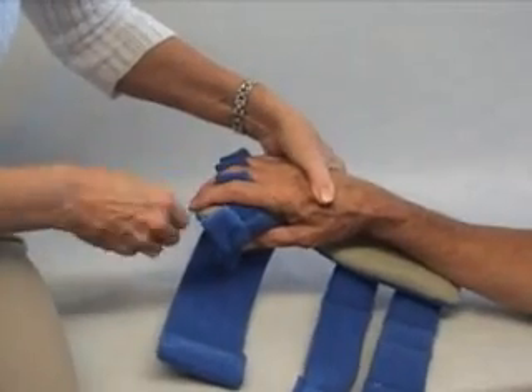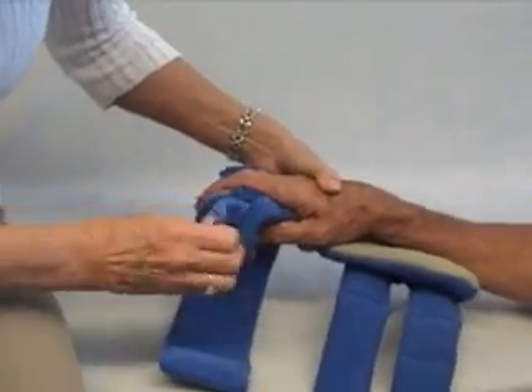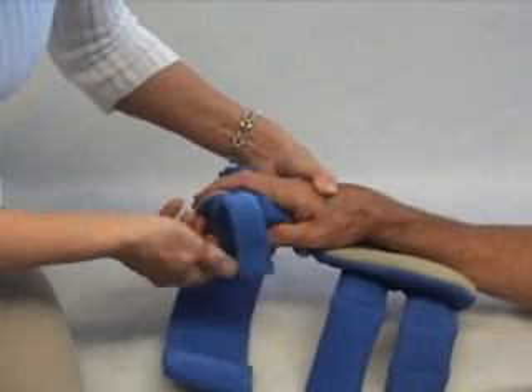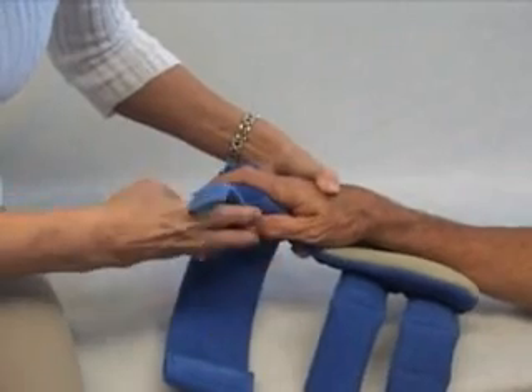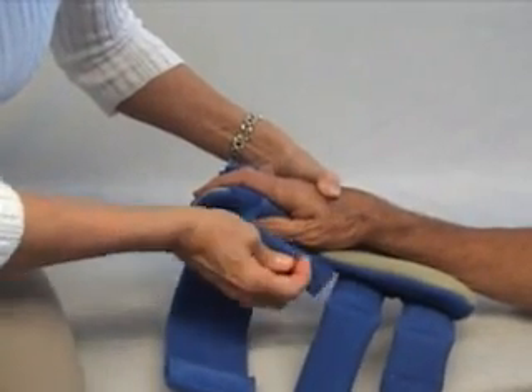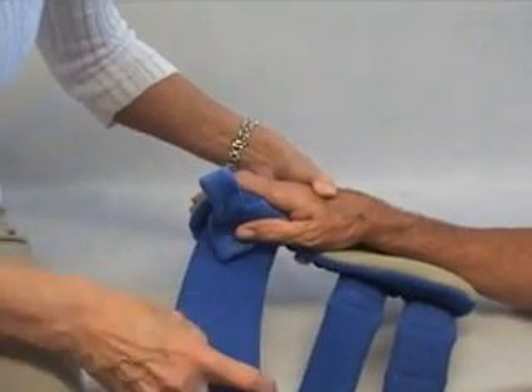Put each finger separator between each finger. You might be able to bring this around the thumb, but you don't want to pull it down. You might anchor it here or just keep it up out of the way — whatever is appropriate for your patient.